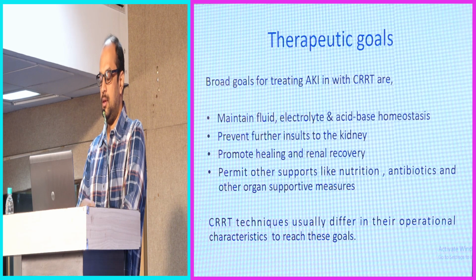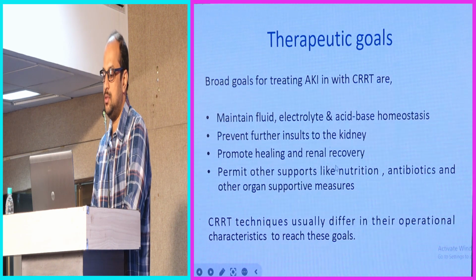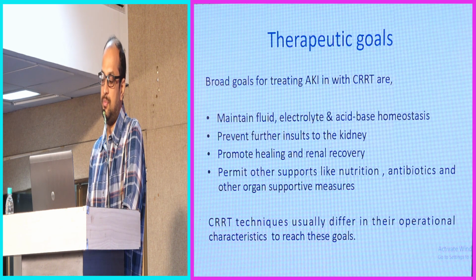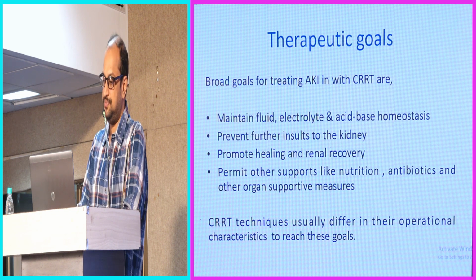Before discussing anticoagulation, we need to know about our therapeutic goals once we start CRRT. The broad therapeutic goals are to maintain fluid, electrolyte, and acid-base homeostasis, we should prevent the kidney from further insults, we should promote healing and renal recovery, and we should promote other supports like nutrition, antibiotics, and other organ support measures. The CRRT techniques usually differ in their operational characteristics to reach these goals.